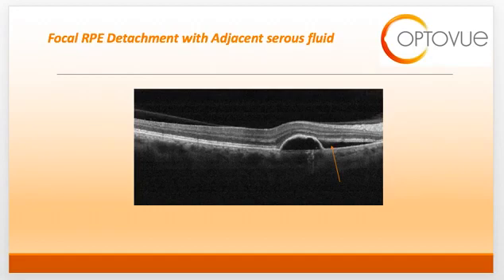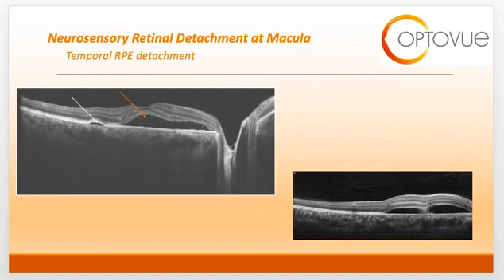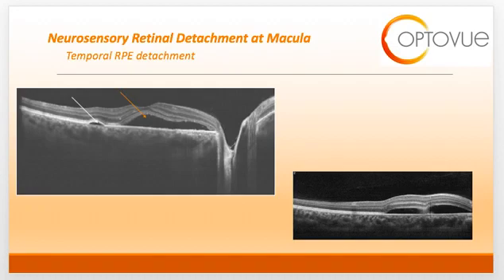This slide demonstrates a serous PED with an adjacent hypo-reflective area of serous fluid in the subretinal space. Whenever you have a pigment epithelial detachment with an adjacent area of serous fluid, you need to rule out the presence of a choroidal neovascular membrane. The OCT on the left shows a serous PED alongside a neurosensory detachment. The white arrow points at the serous PED and the orange arrow at the neurosensory detachment. Note that in the PED the RPE is elevated, while with the neurosensory detachment the RPE has stayed in place. On the bottom right, you can see a bilobed serous detachment with exudation in the center.